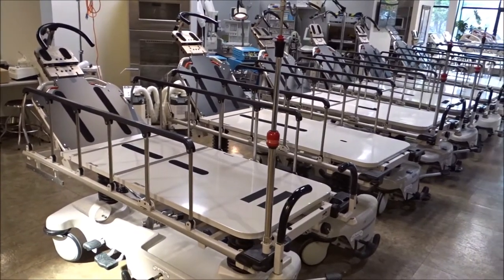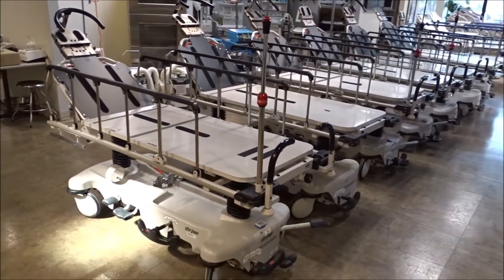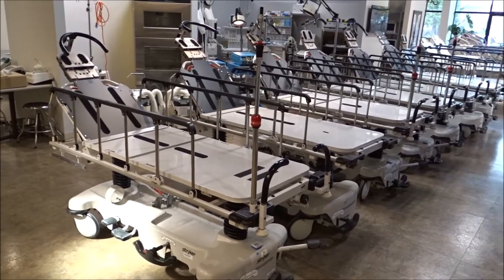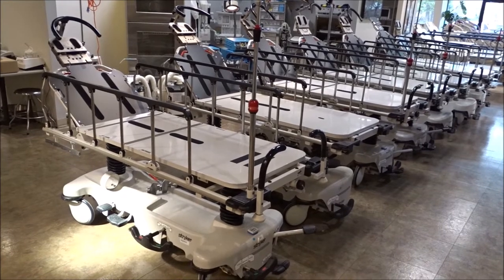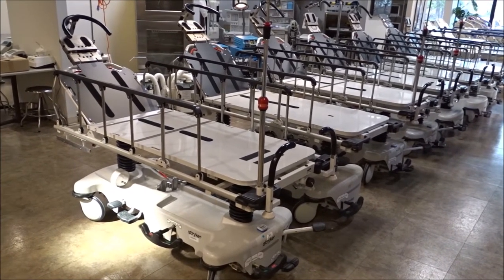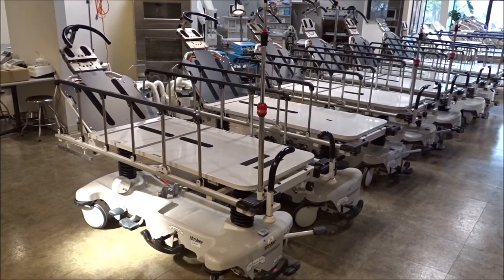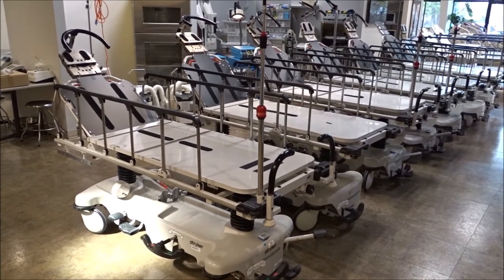All 1069s have them and a lot of the 1068s do as well. So if you're looking for something for an international hospital, an international surgery center, or any type of surgery center doing head, neck, or different types of surgical procedures, these are going to be some of the best stretchers you can buy in the used refurbished market.